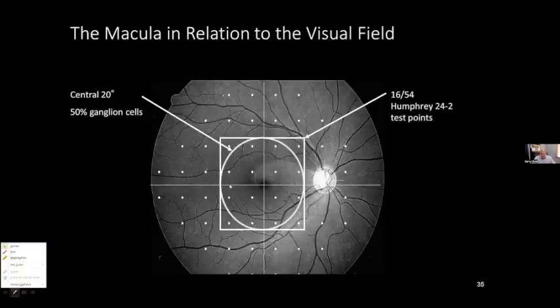And that was a conflict because you never knew whether those points were related to cells responding on the superior or inferior hemiretina. The reason then is that they shifted the template in order to avoid the stimulation of the vertical and horizontal lines. And that's basically the difference for the midline.